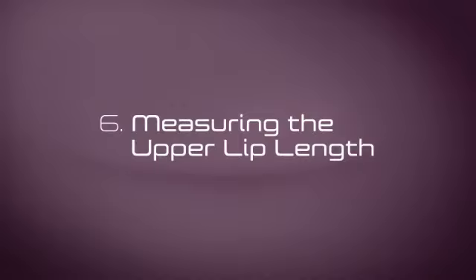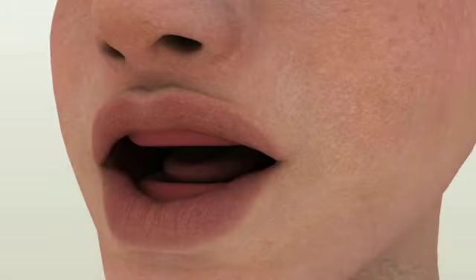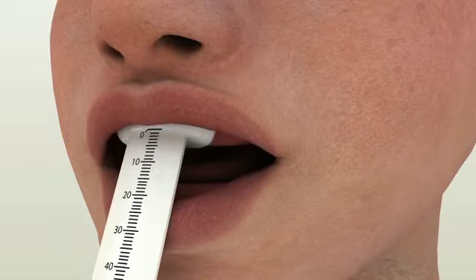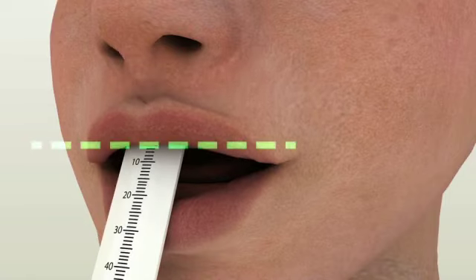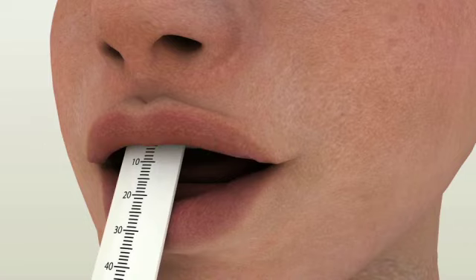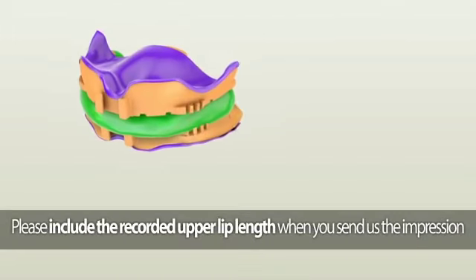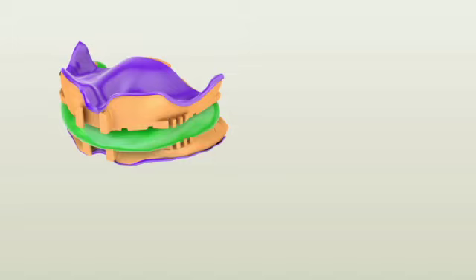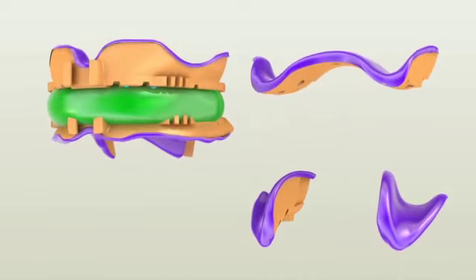Measuring the upper lip length. Utilizing the Pala Digital Dentures lip ruler or any lip ruler you have, measure the upper lip length. Measurement should be from the incisive papilla to the upper lip line, which will be needed for the online order process. After placing your order online, pack everything and ship to Heraeus Kulzer's Pala Digital Denture Center. In the box you should include: 1) anterior parts of both maxillary and mandibular impressions with bite registration material in between, and 2) detached posterior parts of both maxillary and mandibular impressions.